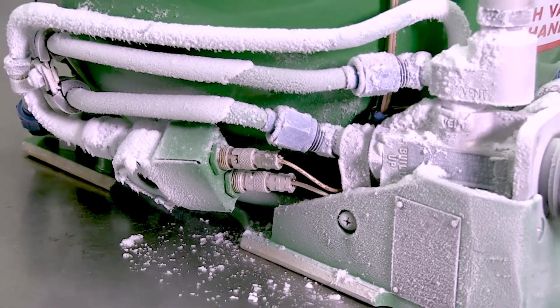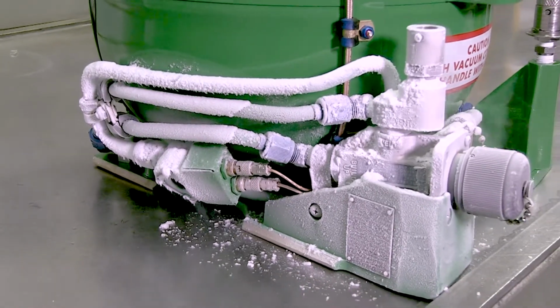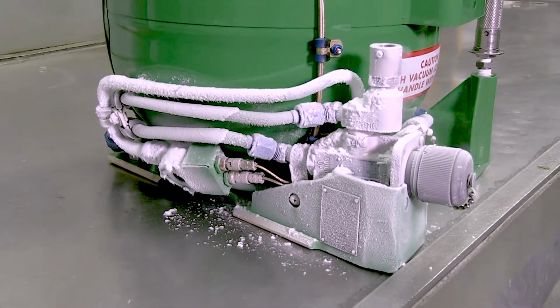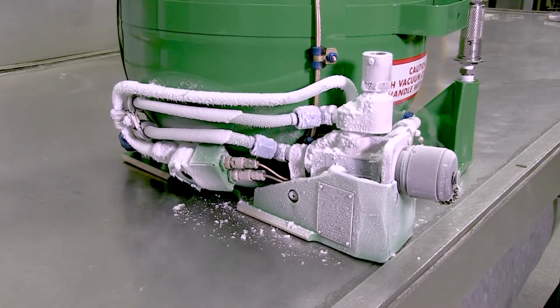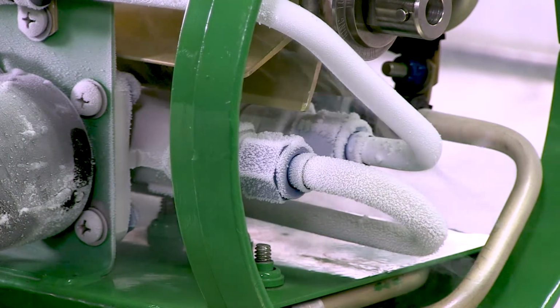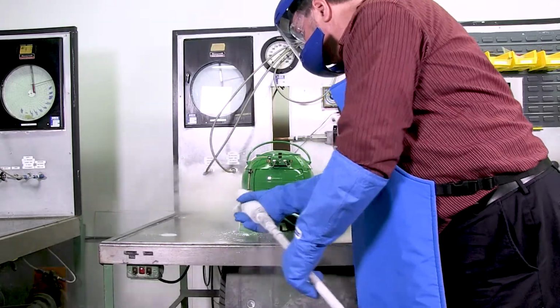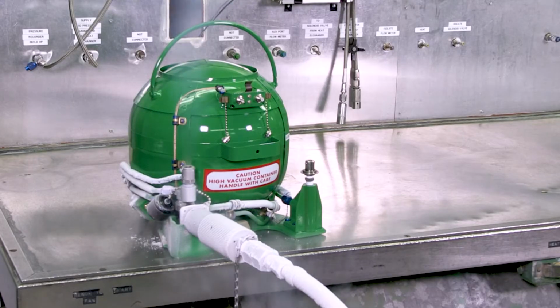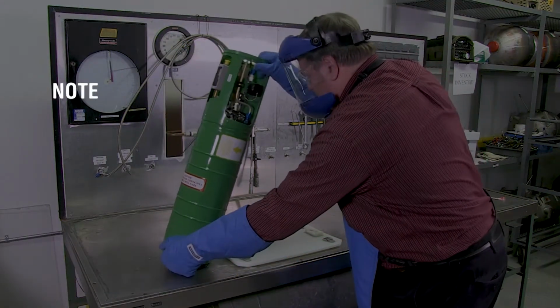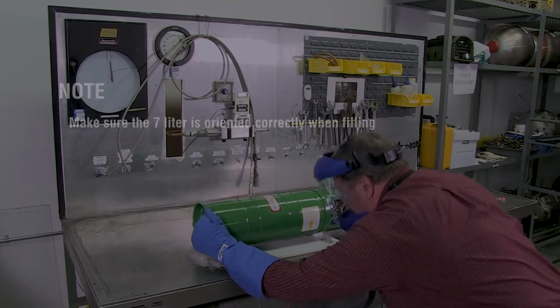If a leak is suspected due to frost on the fittings or lines, and the purge procedure does not solve the issue, then you should perform a vented evaporation loss test. This will evaluate the ability of the converter container to retain liquid over a 24-hour period and should be done immediately after a unit is filled. Fill the converter to capacity with liquid oxygen. Note: make sure the 7-liter is oriented correctly when filling.